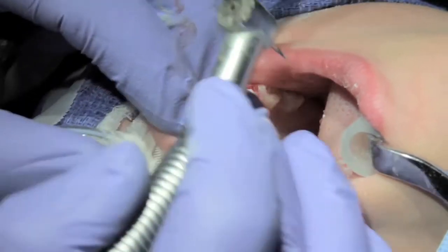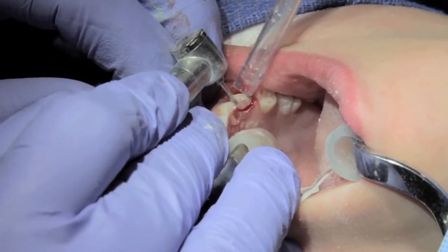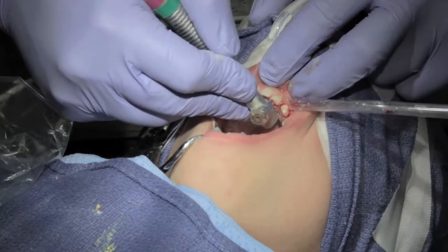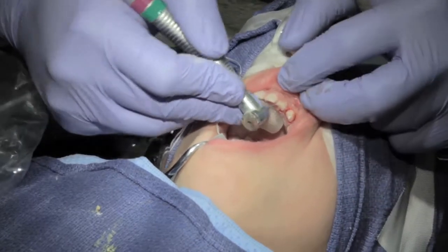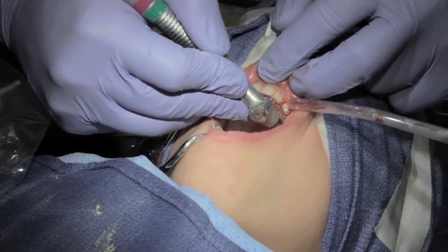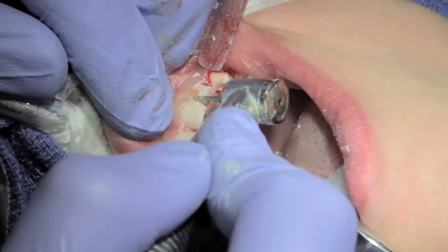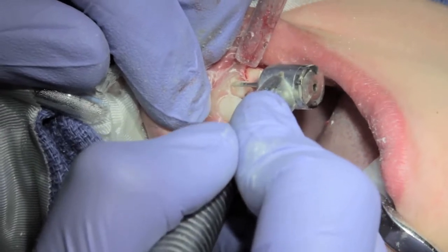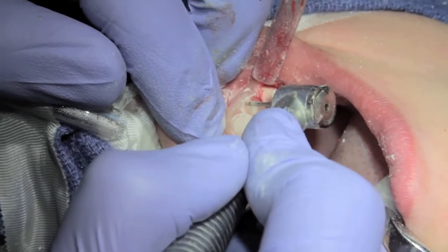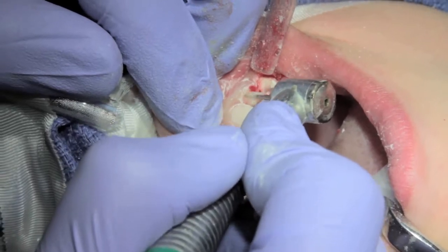I'm also going to prep the tooth next to it and then we can fit those crowns. Same thing in the front: occlusal reduction, which depending on the decay is usually about a millimeter and a half to two millimeters. Then you do interproximals — again the height of the cutting bur — I put the top of it at the occlusal height of the reduced plane as my guide to know how deep to go.